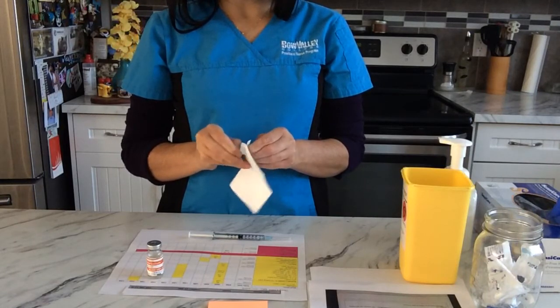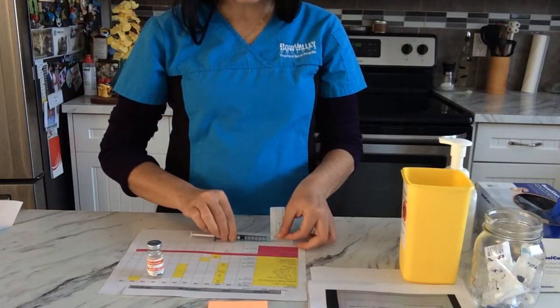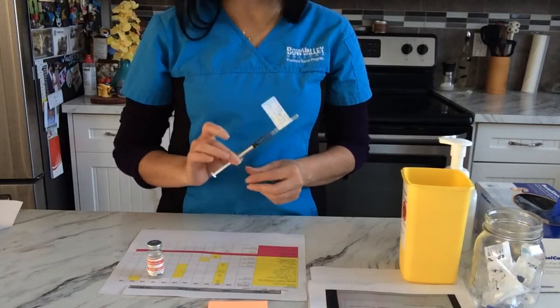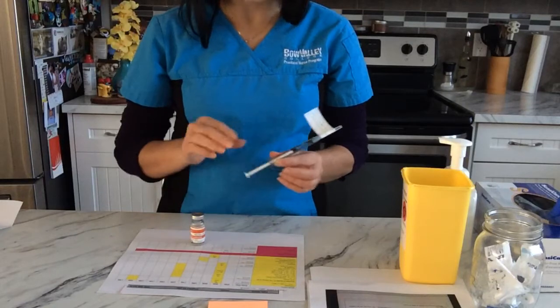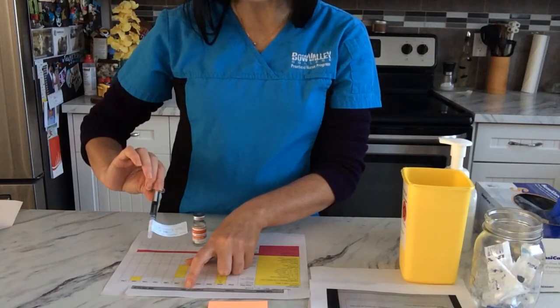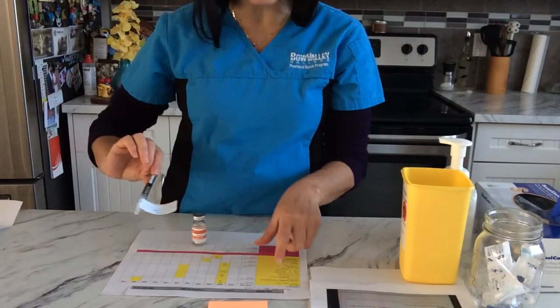So I'm gonna attach it, I'm gonna put it on here. Now I'm gonna do my third check with my label and the vial and the MAR. So we have Parks Marta, female, hospital ID 121-2392, date of birth 1956, February 20.